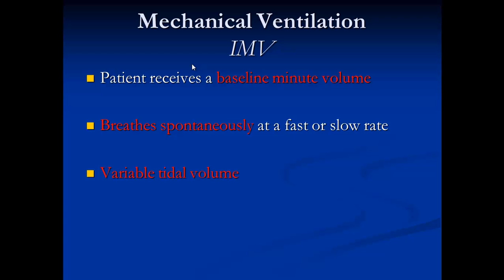But we have increased in practice. In clinical practice, we could give pressure support of 15, pressure support of 20, and then come down to pressure support of 12, pressure support of 10. We have never gone as low as 8 to 5. When the patient is already on pressure support of 10, we could start a CPAP trial.